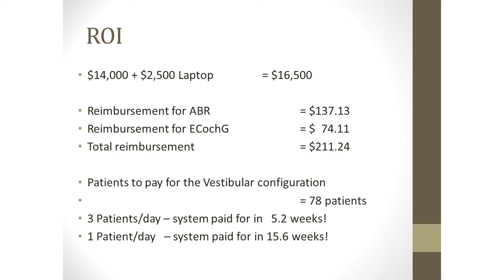An ECOG doesn't really have to take that long. I told you that a CVEMP doesn't take long, or an OVEMP, because you're only doing this for about 10-15 seconds per run, and you do four runs, two on each side. So that's a very, very quick test. And these too, I never do over 1,000 stimuli at about 10 per second. So there's no reason why you couldn't do both ears in 20 minutes on this, if you're getting a response.